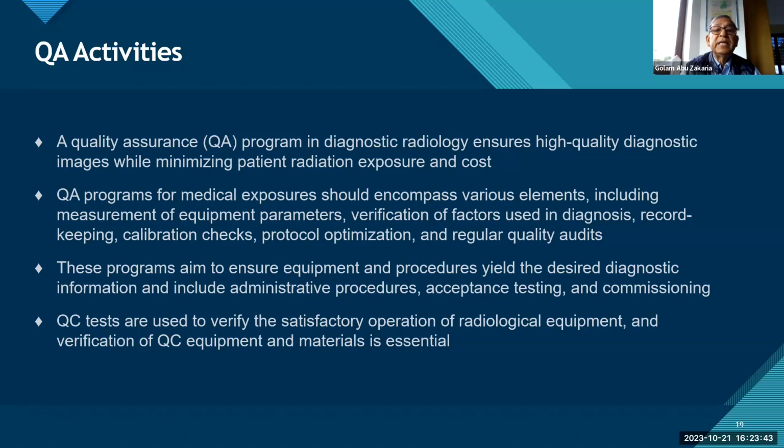A QA program for medical exposure should encompass various elements, including measurement of equipment parameters, verification of factors used in diagnosis, record keeping, calibration checks, protocol optimization, and regular quality audits. These are all parts of the quality assurance program.